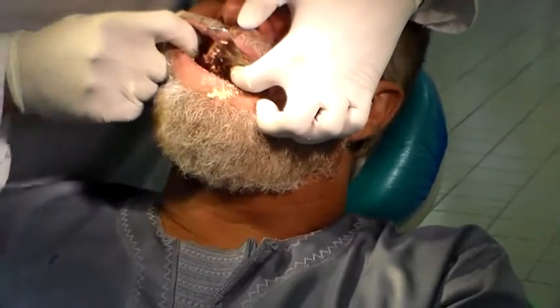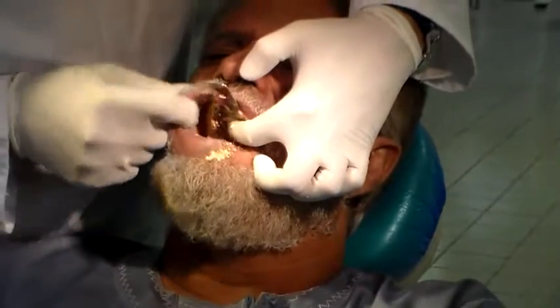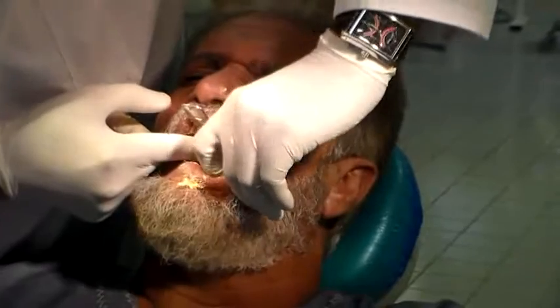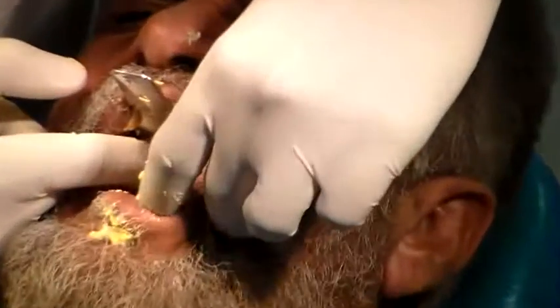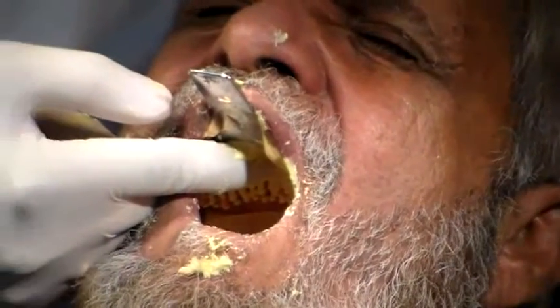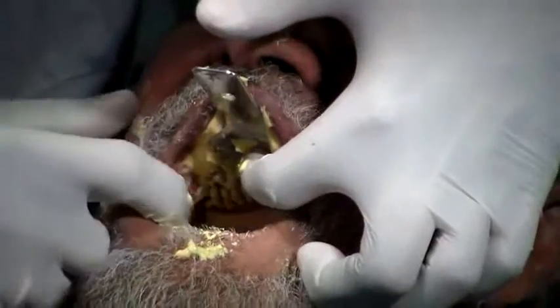Wait for a few seconds. Look for the material to start changing its color and then start to mold. You need to keep looking because the material will be flowing. Sometimes you want to give it a second's rest so the material will flow correctly and then you come back to the molding again.